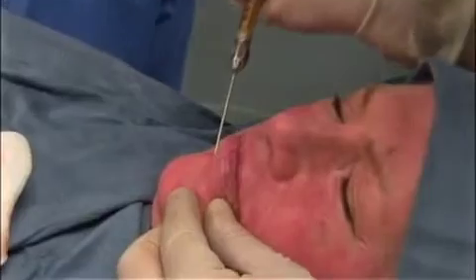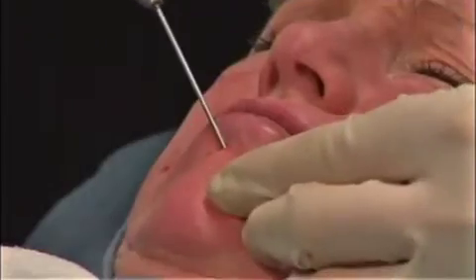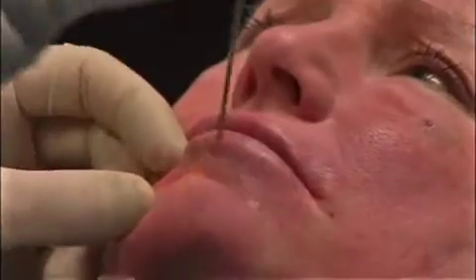Rarely people prefer the mental crease to be blunted, and this is performed using a larger cannula, 1.8 millimeters in diameter, to deposit fat cells along the mental crease.